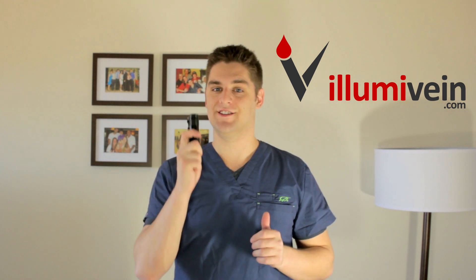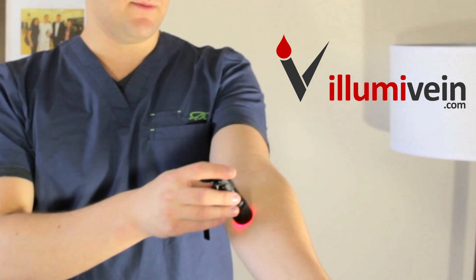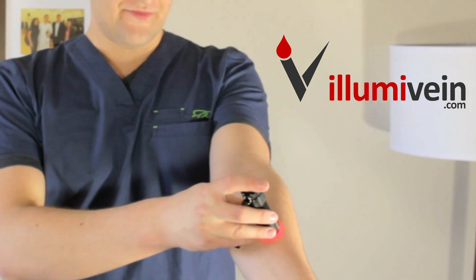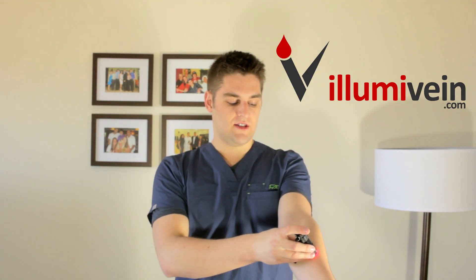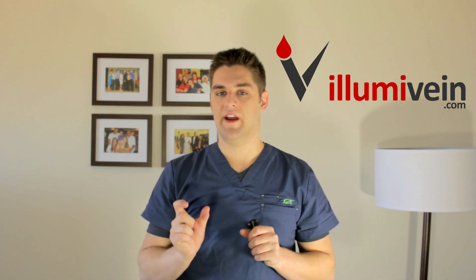This is the solution. This thing casts a super bright red LED light that you gently press against someone's skin. You'll see a nice red glow around and you'll start to see, as you move it, these dark shadows. These are your veins. The darker the room the better, but you'll see this dark shadow that clearly shows you where the veins are.